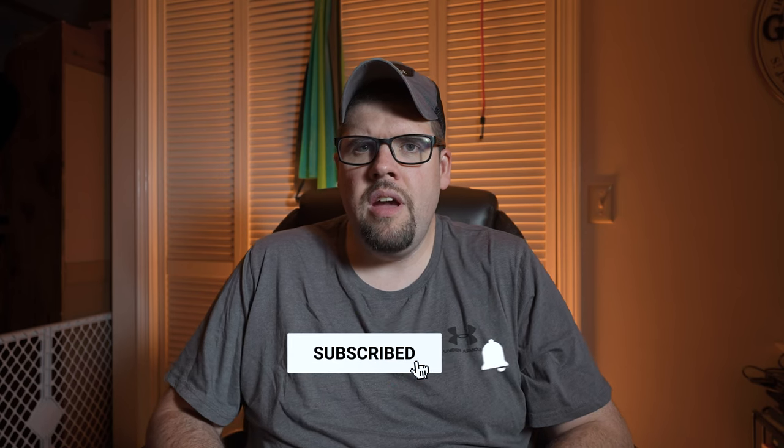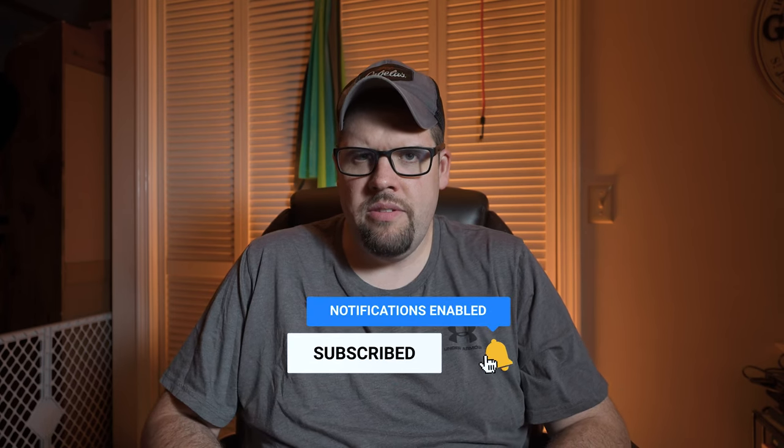Tim here from Getting Epic. I just received this package in the mail — it came from iRhythm Technologies. I'm going to show you how I'm going to put on my Zio patch. I recently went and saw my cardiologist for my hypertrophic cardiomyopathy, and during my echo I was having a lot of PVCs.